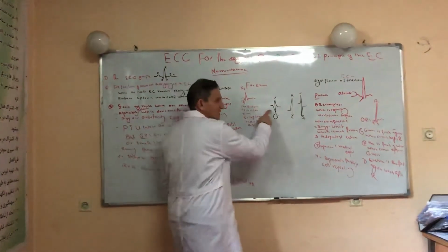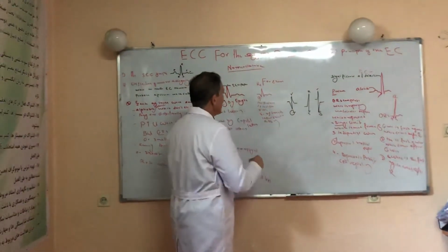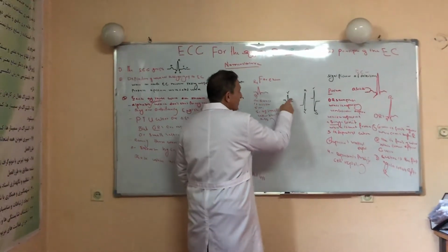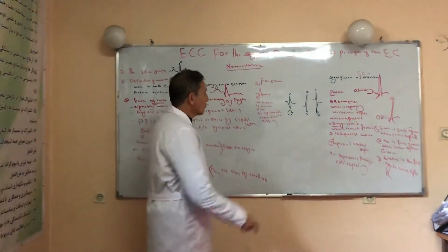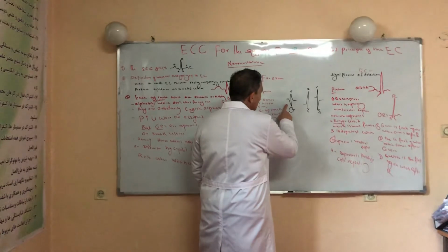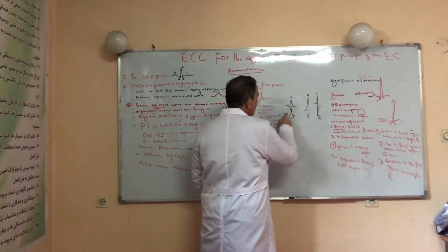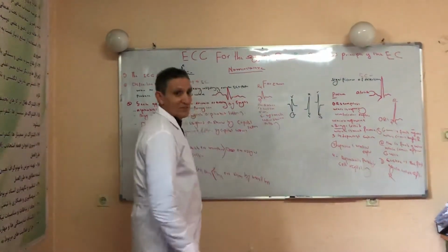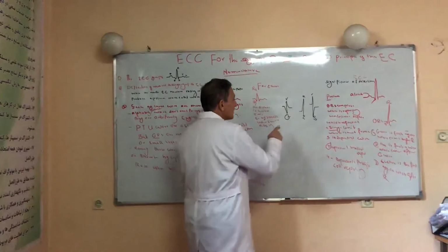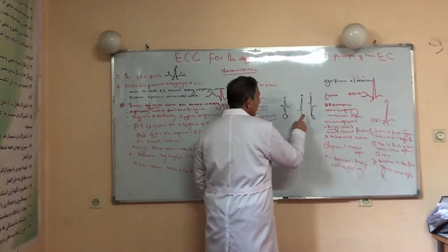Right now we come to the next topic. In this QRS complex, the Q wave is larger, but the R wave is smaller. So the large wave is assigned a capital Q, and the smaller wave is shown by a small r. In this second complex, we have R wave, Q wave, and S wave.